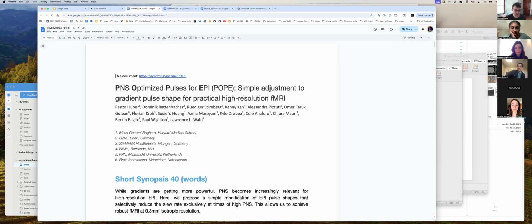And you can optimize PNS in many ways. You can optimize your model, like here Bastien is doing with deep learning models as well, and more informed physiological models. You can also try to optimize PNS based on different gradient wires, like Matthias Davids has done with Larry Wald. However, here I'm using a different approach, namely I'm optimizing my sequence.